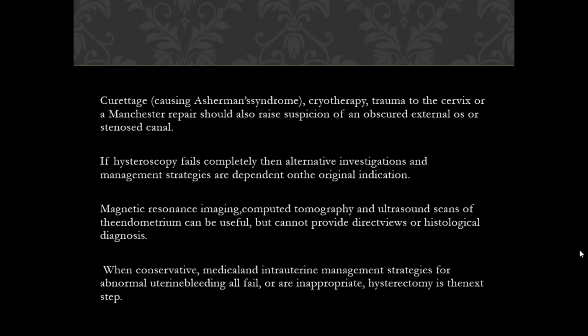Saline is ideal for diagnostic procedures and bipolar electrocautery. Normal saline for hysteroscopy with bipolar cautery. But if the machine is monopolar, glycine will be ideal.